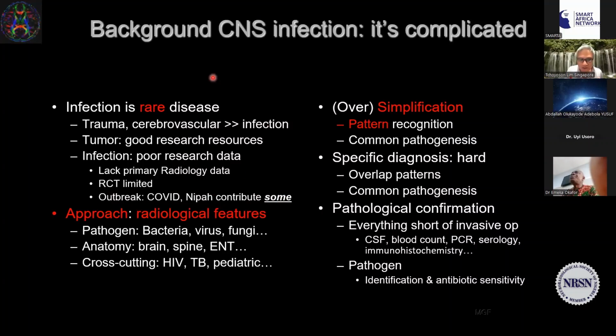So in this background, we understand that infection seldom comes to MR scanning, but when it does, we should be prepared to distinguish the approach to radiological features.